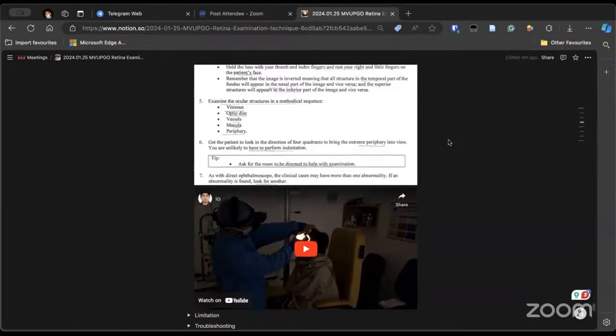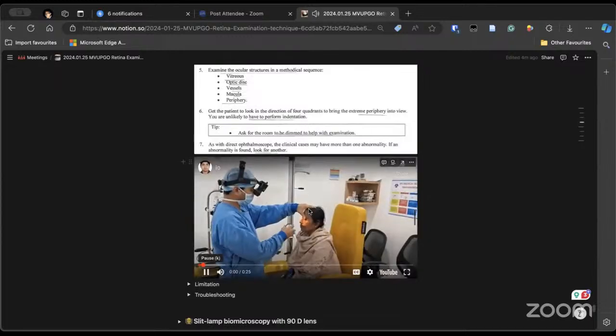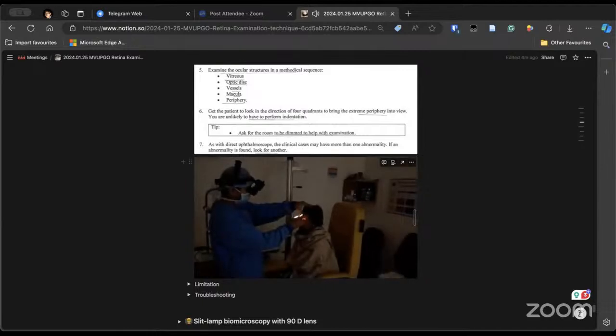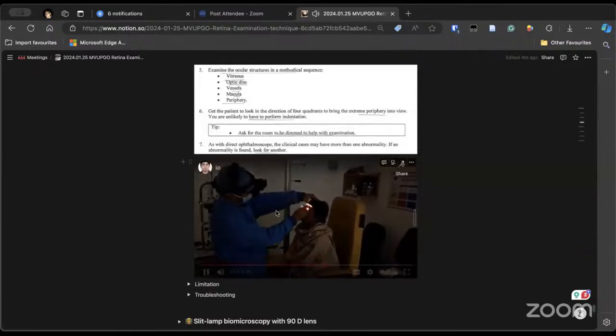So obviously there is more than one approach. This is just a routine clinical approach which I use. Tell the patient what is expected from them, and what I am doing is just tapping there so that he or she looks there. And see, what I am doing is I am rotating my head.